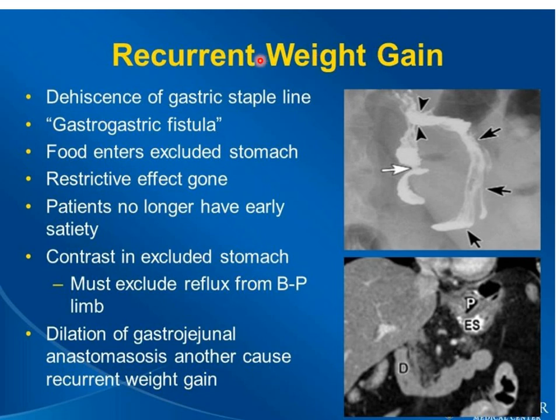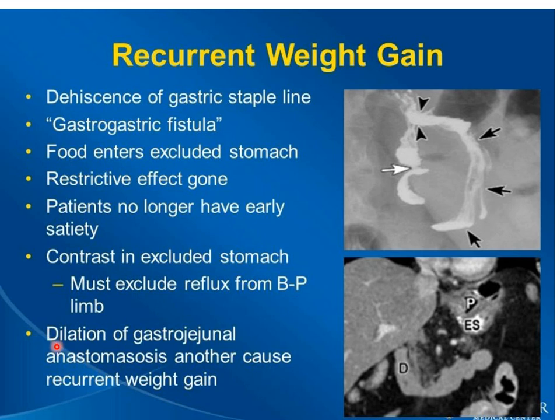Recurrent weight gain occurs with Roux-en-Y bypass surgery due to dehiscence of the gastric staple line or a gastrogastric fistula, in which food enters the excluded stomach and the restrictive effect is lost. Patients no longer have early satiety. Contrast seen in the excluded stomach is shown here, due to the fistula between the excluded stomach and the small gastric pouch. Dilatation of the gastro-jejunal anastomosis is another cause of recurrent weight gain — not just fistula or dehiscence, but dilatation of the anastomosis itself.